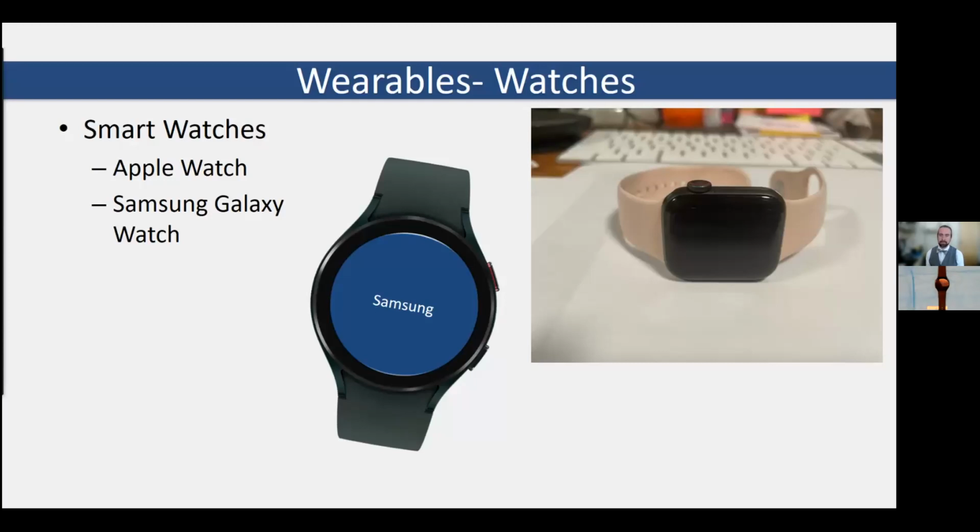Most of our smartphones and things like that, we charge while we're sleeping. But if we want to get that sleep data, to track how our breathing is and how much sleep we're getting at night, we want to be able to use the device and charge it at the same time. So building in longer battery life, and as these improve and we get charge times and run times in the 3 to 5 day range from a device like this, will make it more beneficial. Back to you, Garrett.